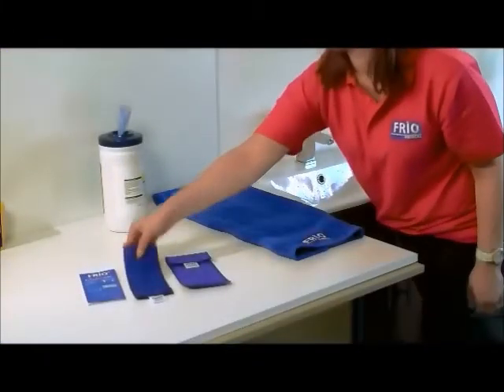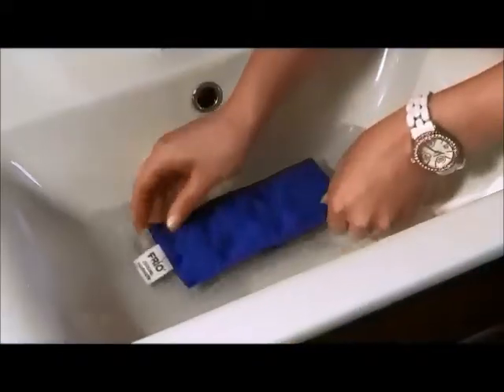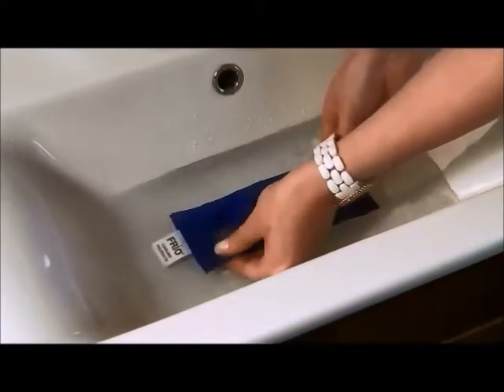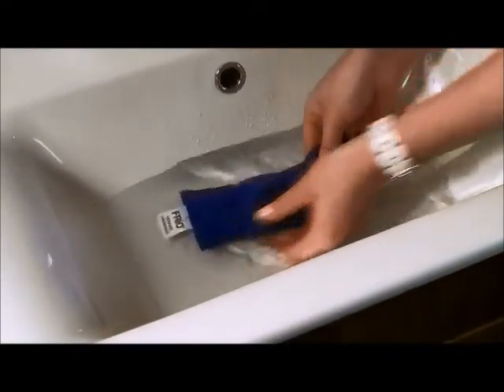To activate, simply immerse the inner wallet in water for the time specified in the instructions. This time will vary depending on the size of the wallet, but it could be up to 20 minutes.